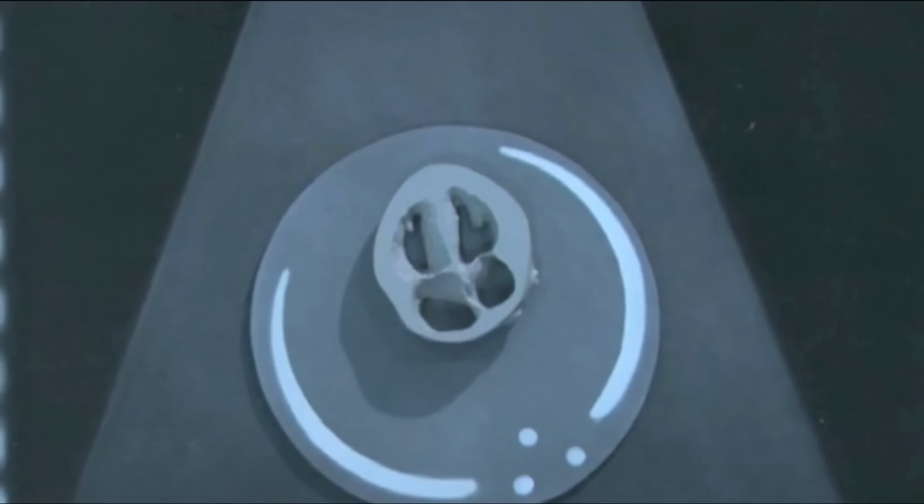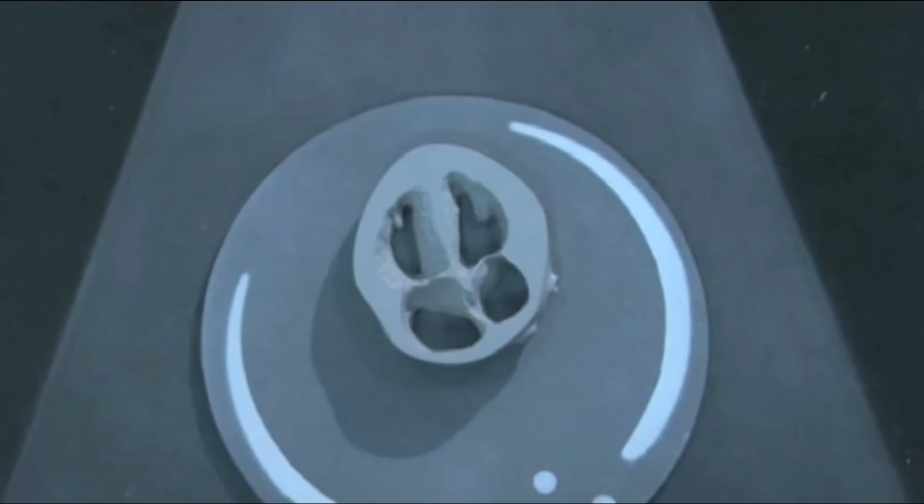Moving on to the other slice, if you open up the model, you'll see that in the position shown, the baby's back is still down and on the right of the screen, but this time the head is into the screen and the feet are out towards us, so the left is here and the right side of the fetus is here. As a result, the scan beams are looking more or less down the length of the interventricular septum, which is why it looks thin in this case.